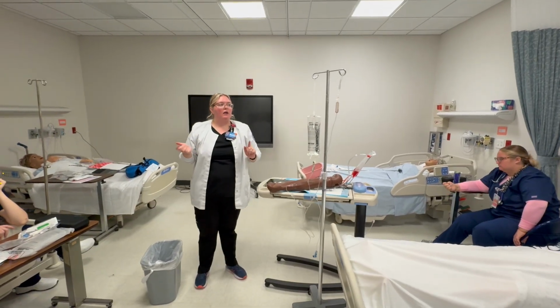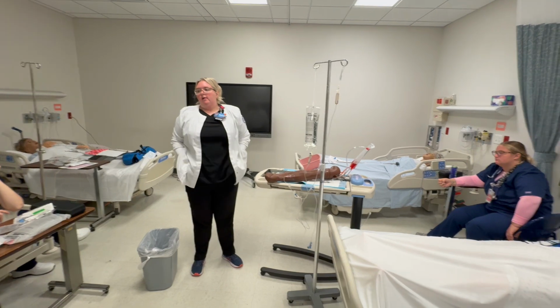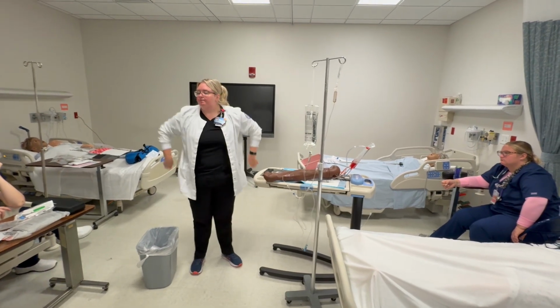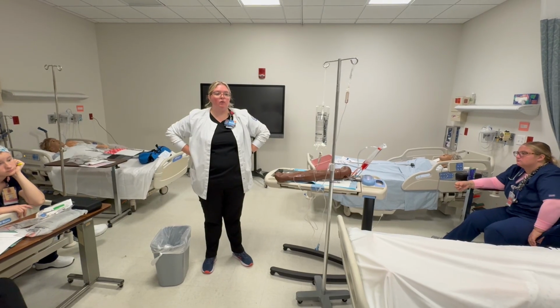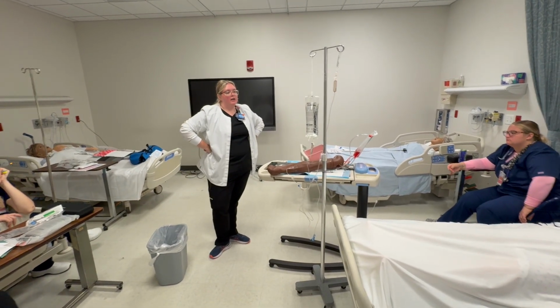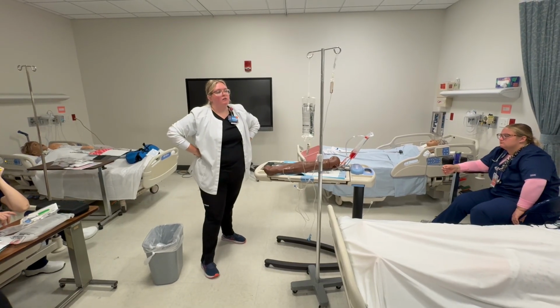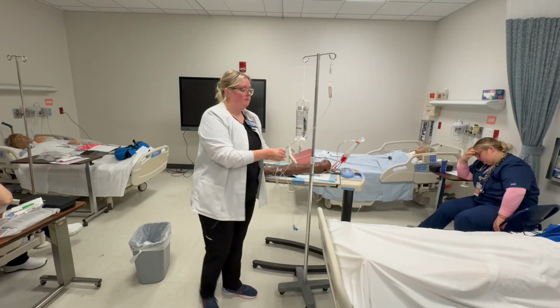What if in checkoff it's not working? What do you guys think? Check your clamps. Yes, that's what I want to see. I want you to use your nursing judgment, recognize that my primary or my secondary isn't infusing for some reason, and check my clamps.